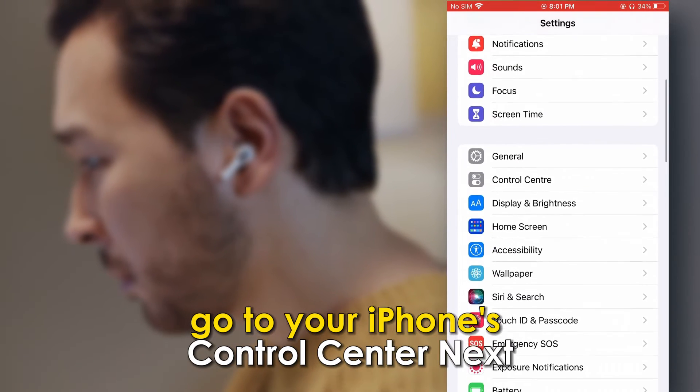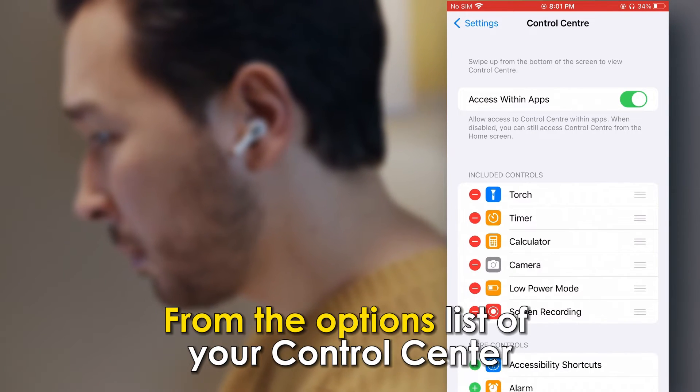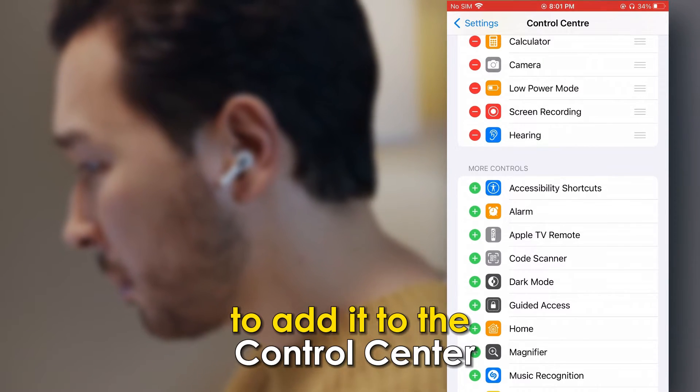go to your iPhone's control center. Next, you'll need to add Live Listen to your control center. From the options list of your control center, tap on the plus sign next to Hearing to add it to the control center.